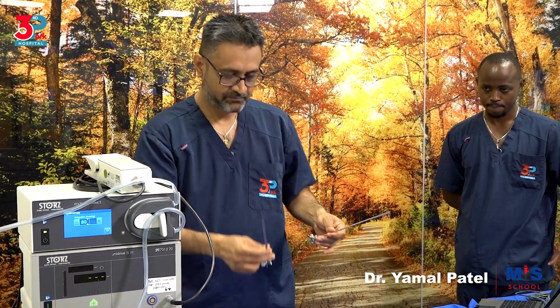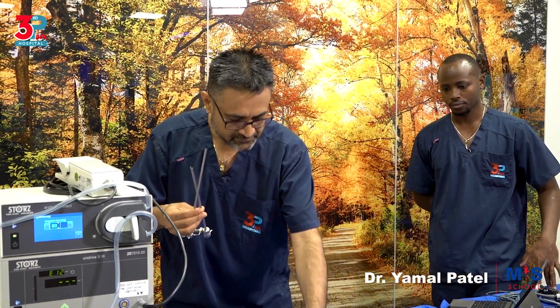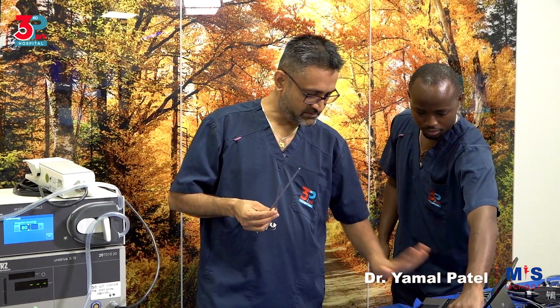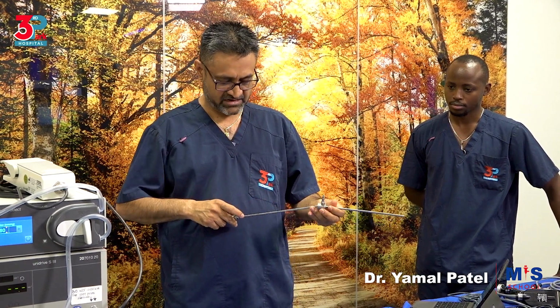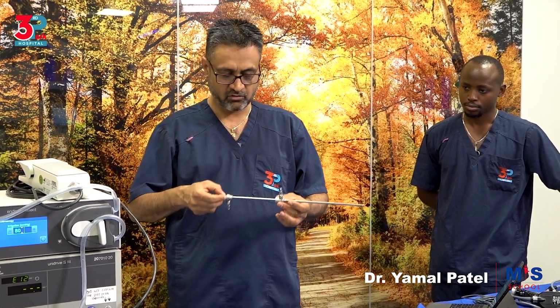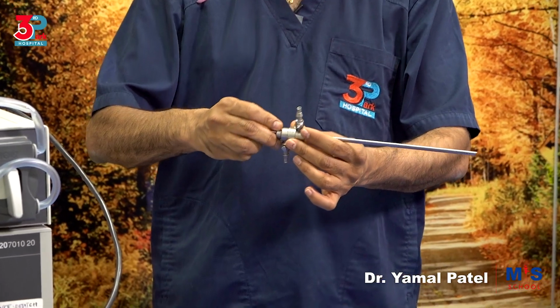The next setup is the sheaths. So we have the inner and the outer sheaths. You have the next other scope? You can use this. Okay, this is a resectoscope. So we have an inner and an outer sheath. This inner and outer sheath, you will need to understand how to connect them first. So connection is based on aligning the 0 with the line with the 0 and no other way. So connect it, align it and lock it.